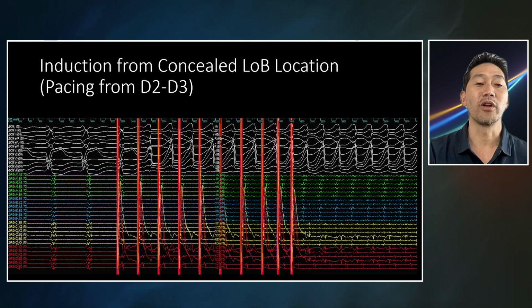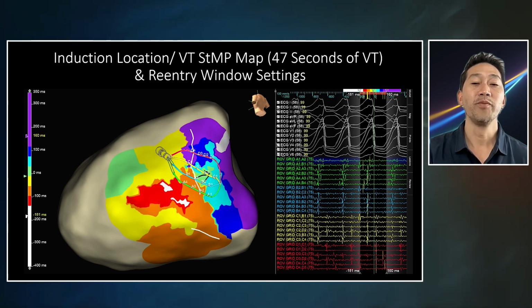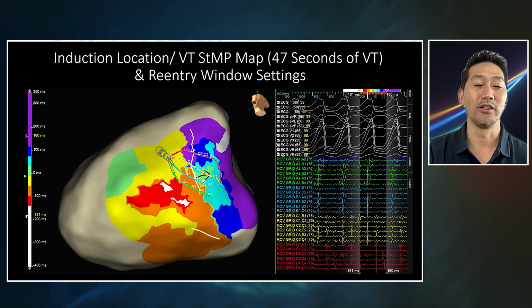That tells you you're in a special area, and you can see the first beat matches the VT, and we were able to trigger a rapid VT that was barely hemodynamically tolerated. With strategic multi-electrode positioning with the grid catheter in that place, we can then see that we were finding diastolic representation, but there was a small activation gap in which we don't record all of diastole, which tells us there's some intramural 3-dimensionality to it.